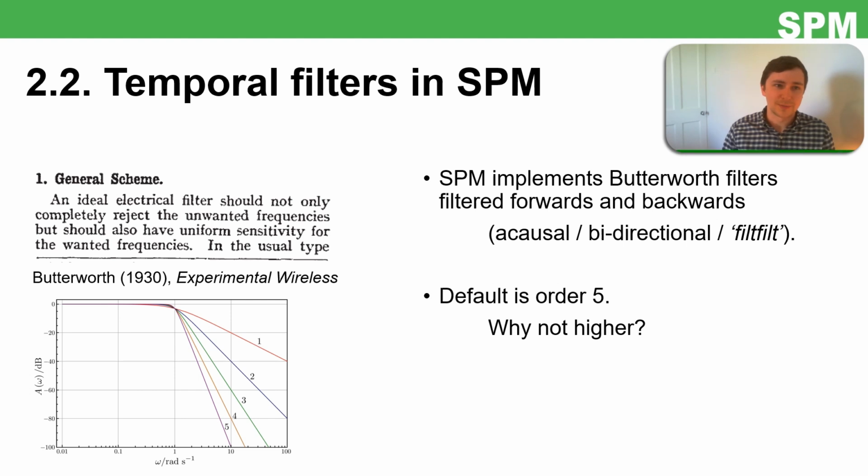And briefly, that's just because there's some ongoing feedback that occurs when designing a Butterworth filter between the data and the filter parameters. That gets increasingly complicated as you increase the order. So anyway, practically, I would just leave everything on the defaults and just try and filter out anything that isn't your signal.